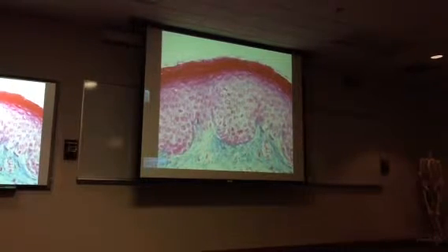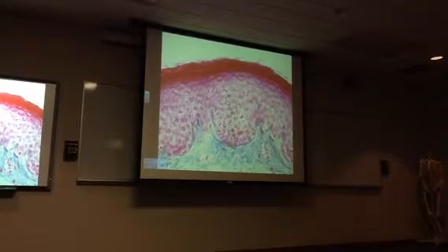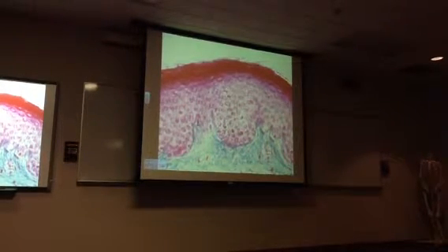On the previous slide, if we didn't include non-keratinized, would it, or do you only add that when it does? It's just stratified squamous. You don't have to say non-keratinized. Just like on a simple columnar, you don't have to say simple columnar with microvilli. Okay? How would we know that the previous slide was not keratinized if we couldn't see the surface?